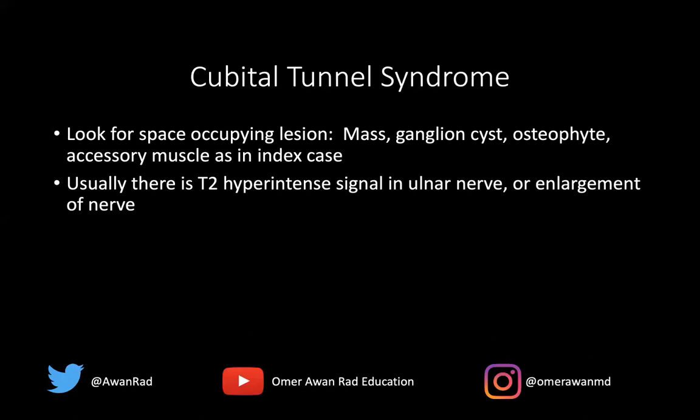There is a wide range of diagnostic possibilities for diagnosing cubital tunnel syndrome. Typically, the nerve is going to be enlarged compared to the radial nerve or the median nerve, and there will be bright signal — it'll look brighter than the other nerves in the other neurovascular bundles about the elbow. That's a nice clue or a nice way to look at it.